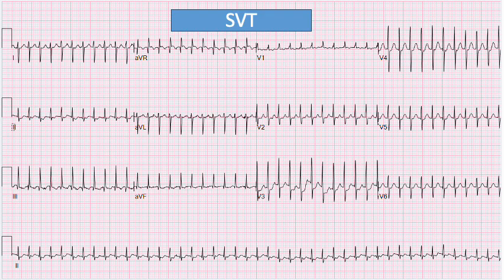Going back to that original lexicon of how we talk about heart rhythm disturbance, with respect to tachycardia, you have a narrow complex tachycardia that is regular. And when you think about the relationship of the A's to the V's, it's really hard to see where there's P waves here. You might be able to convince yourself that there's a retrograde P wave coming through here. But either way, this morphologic appearance looks pretty consistent with SVT.